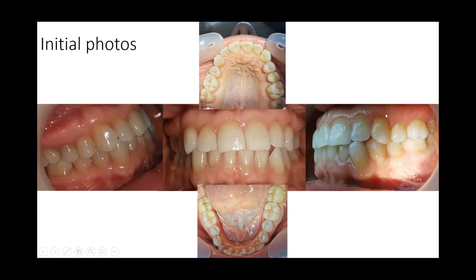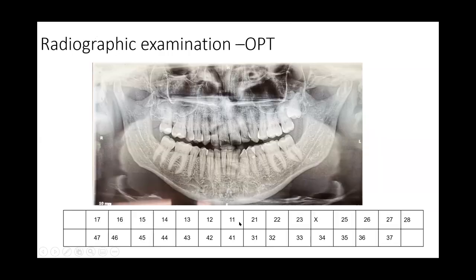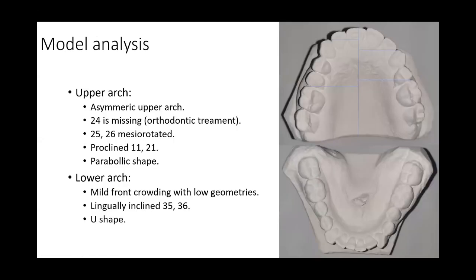So the nature of the problem is orthodontic. This is the OPT. There we see the asymmetrical upper arch.